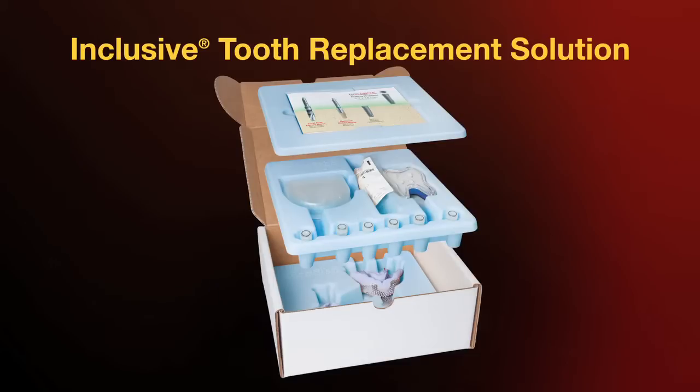Welcome to the Gladwell Laboratories Inclusive Tooth Replacement Solution. The tooth replacement solution is a comprehensive, restorative-driven implant treatment option for the replacement, temporization, and restoration of single missing teeth. This video will present a detailed overview of the components of the inclusive tooth replacement solution, as well as a review of the step-by-step process for ordering the components and utilizing the system in your single tooth implant cases.